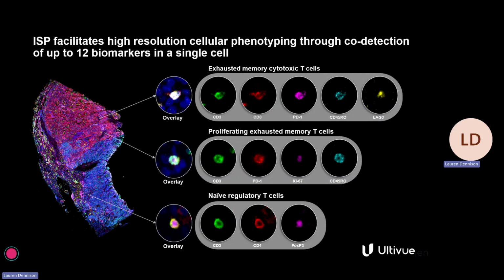Now, of course, the next thing you have to do is to phenotype all of these millions of cells to be sure what proteins they actually express. And there again, you want the software that does this to be able to do 2 things. It has to work very accurately, robustly across tissue conditions. And second, it also has to scale well, because it's millions of cells. We always image the full slide, not small fields of view. And you might have 50, 60, 100 samples in your cohort. So it has to scale also across larger numbers of samples.